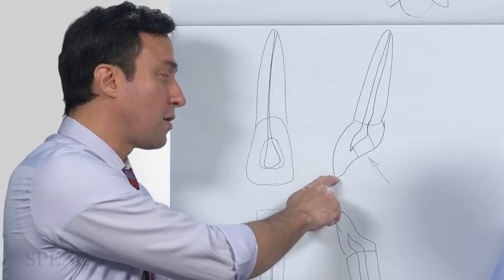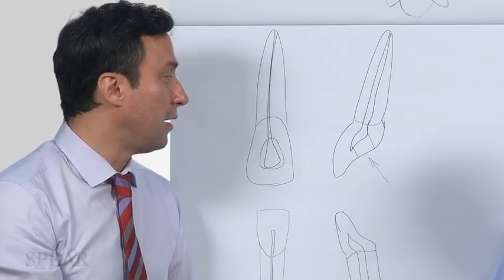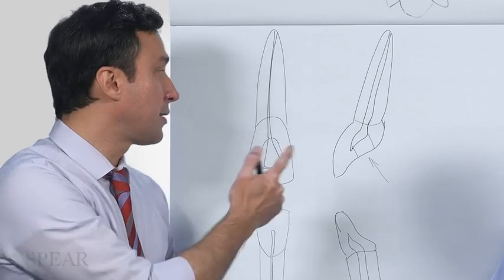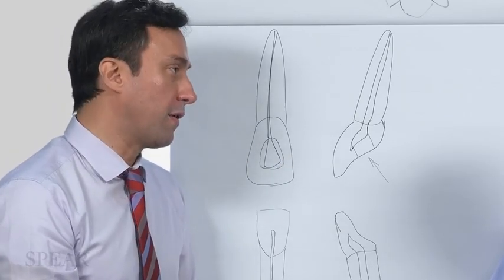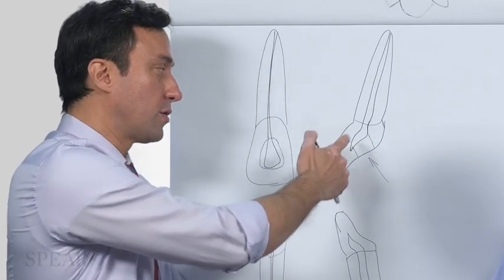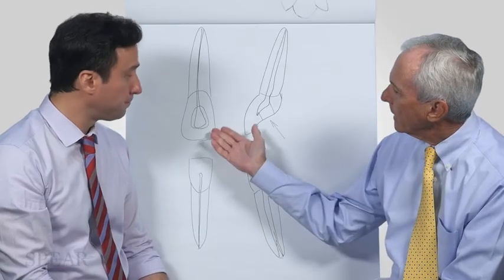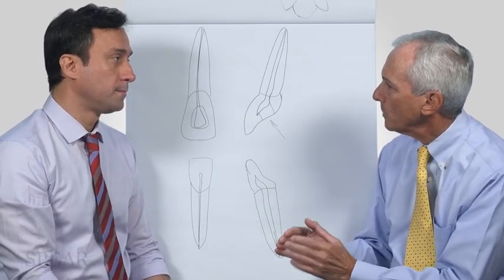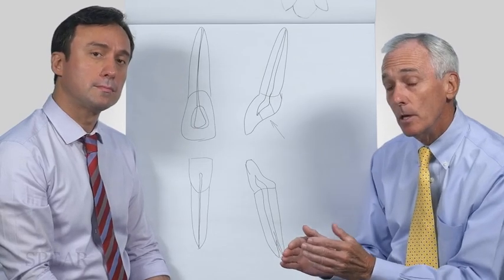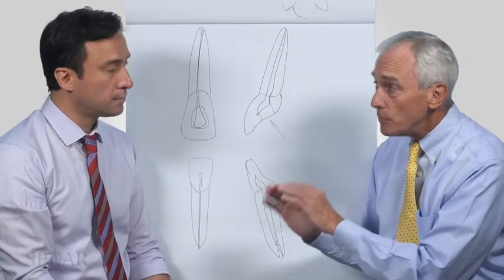Your working length is always determined from your incisal point as the best and most viable place. On maxillary central incisors, most of the time you only have one canal, so it's fairly easy. The key is just to make sure that it's completely unroofed so that you have no tissue or bacteria remaining. I like to think of it in terms of the outline form of your access preparation, which should mimic the surface you're cutting through. This is for all teeth.